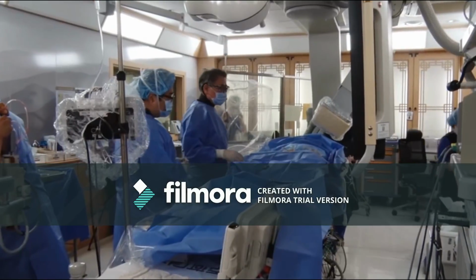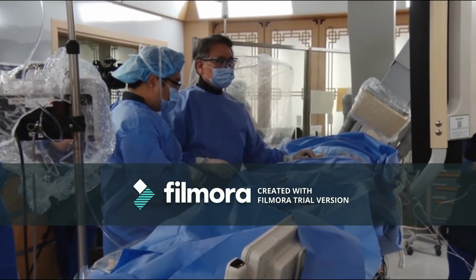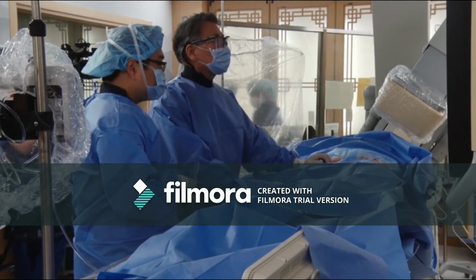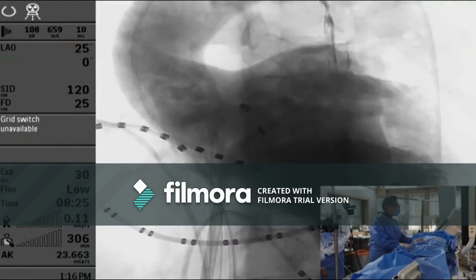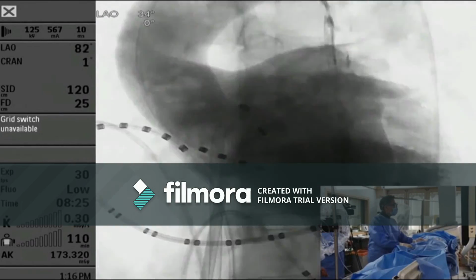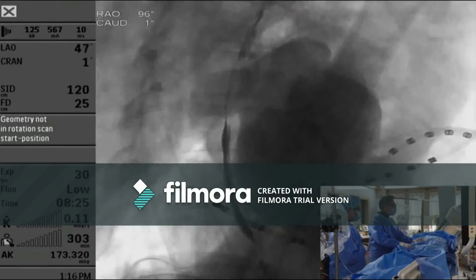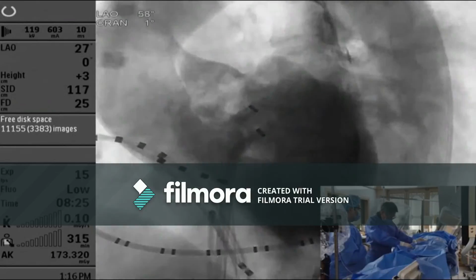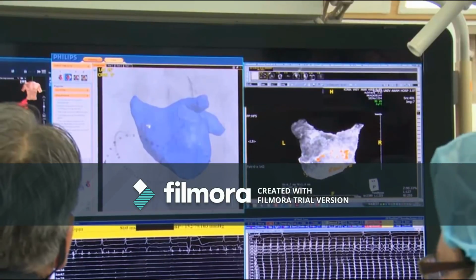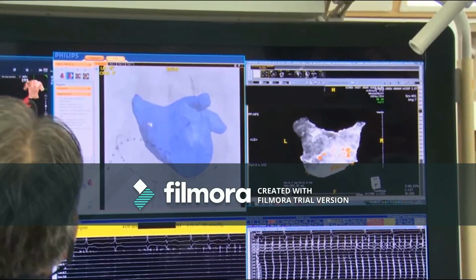So injected through the 6 French pigtail, 26 per second, and a 4-second rotation angiography. Okay. Good. Geometry, I think it's done.